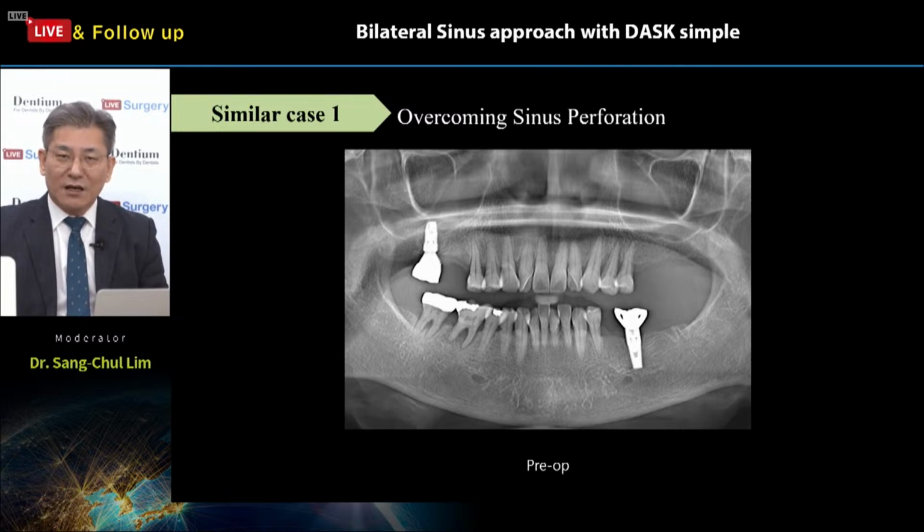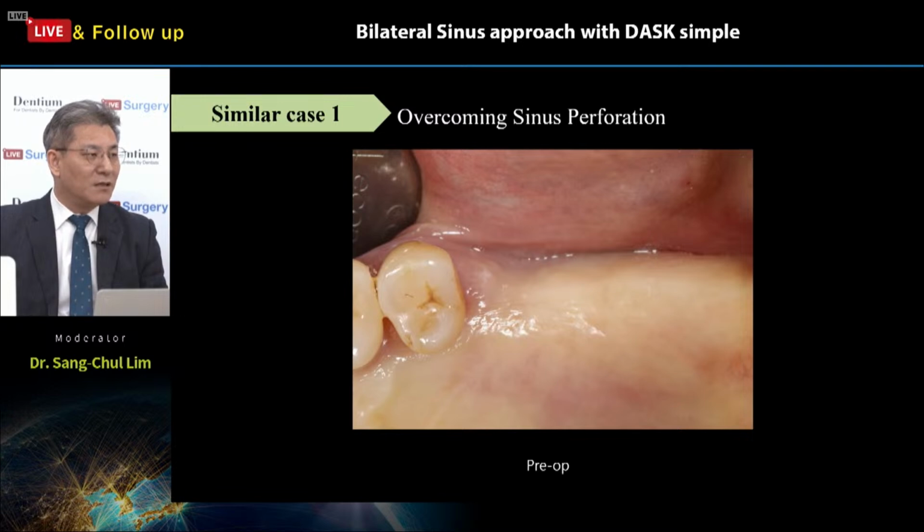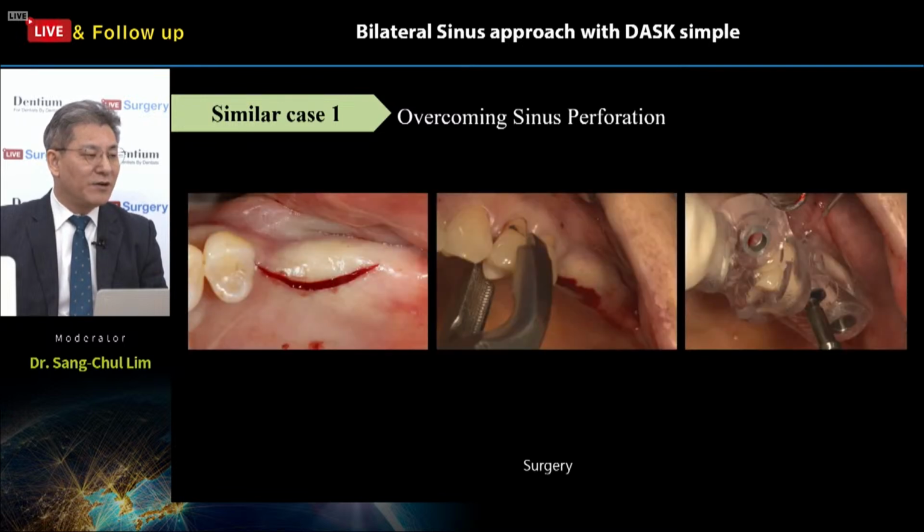At this time, in that kind of situation, we can do the lateral approach for overcoming this sinus perforation. A small semilunar incision with the surgical stent, so minimizing incision, drill and implantation. That was the target and priority for this surgery.